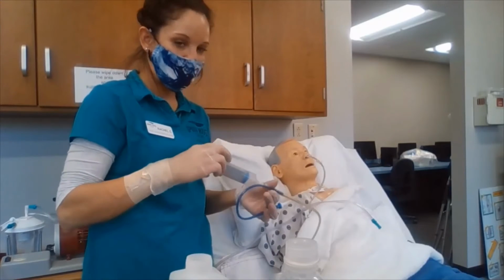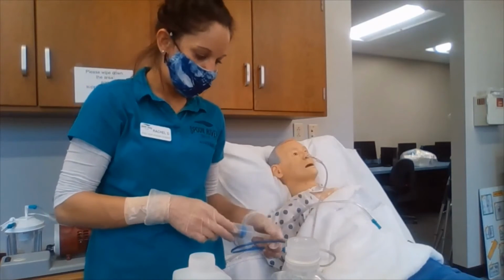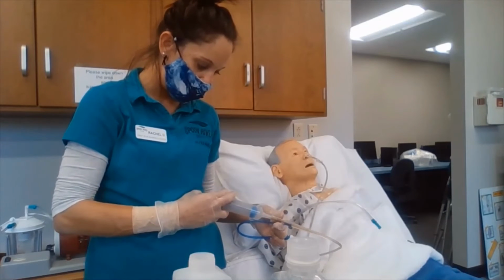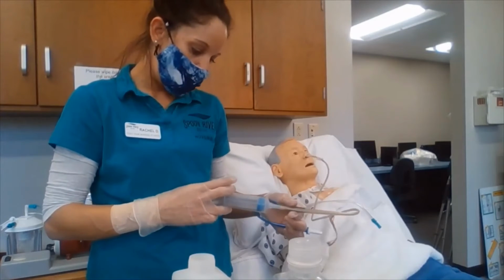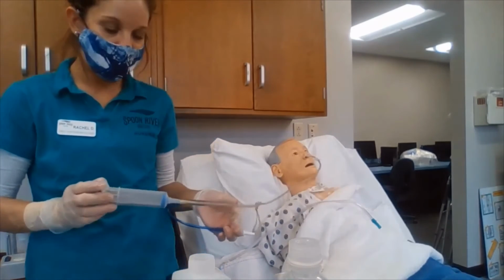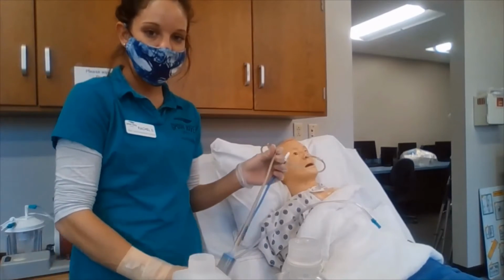So here I have 20 milliliters of solution. Making sure not to insert fluid into the air vent. We are going to be inserting our solution very slowly without forcing it. So we are going to be inserting, and then we are going to be putting the G-tube pointing it downward, or I should say lowering the end of it.